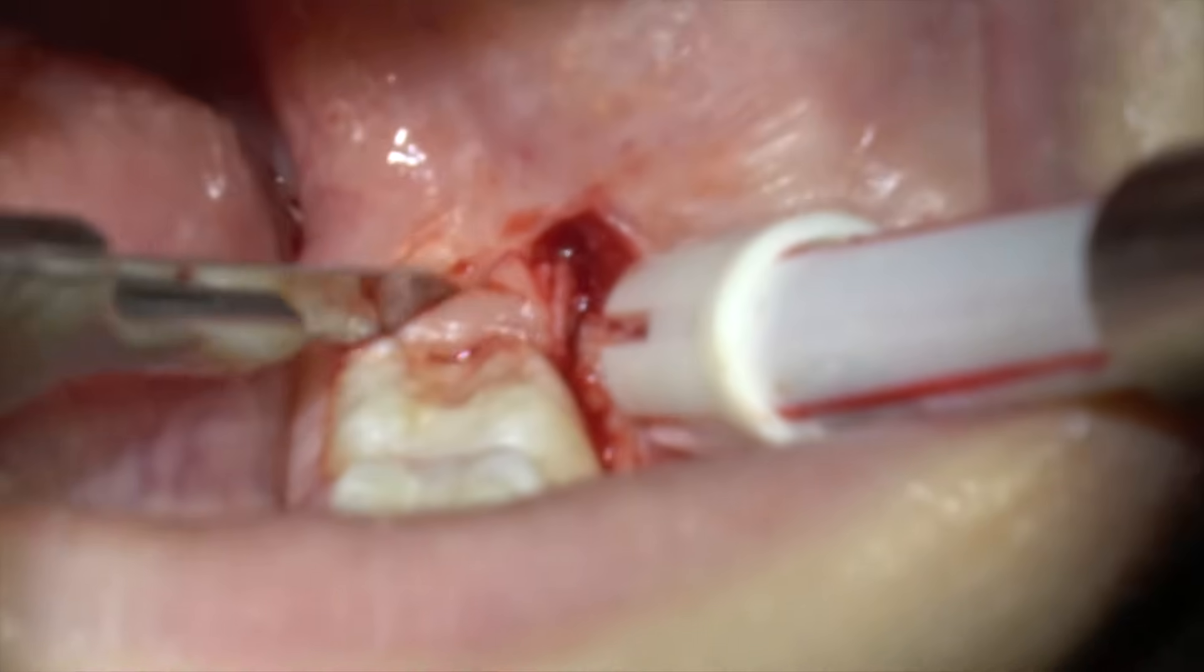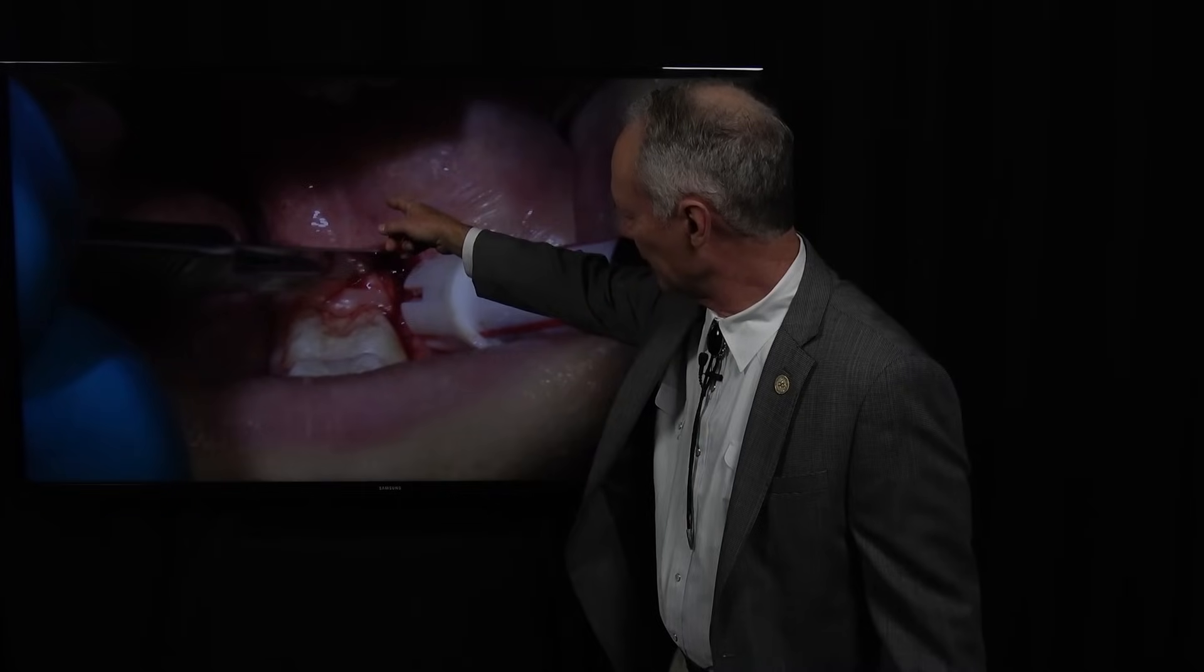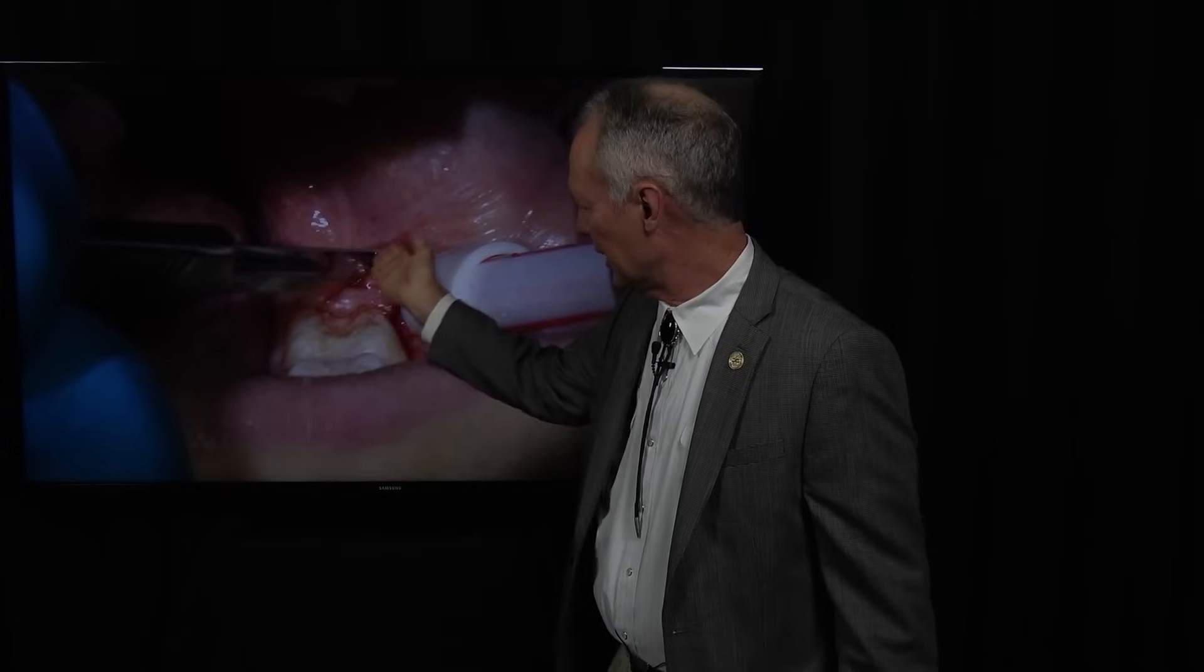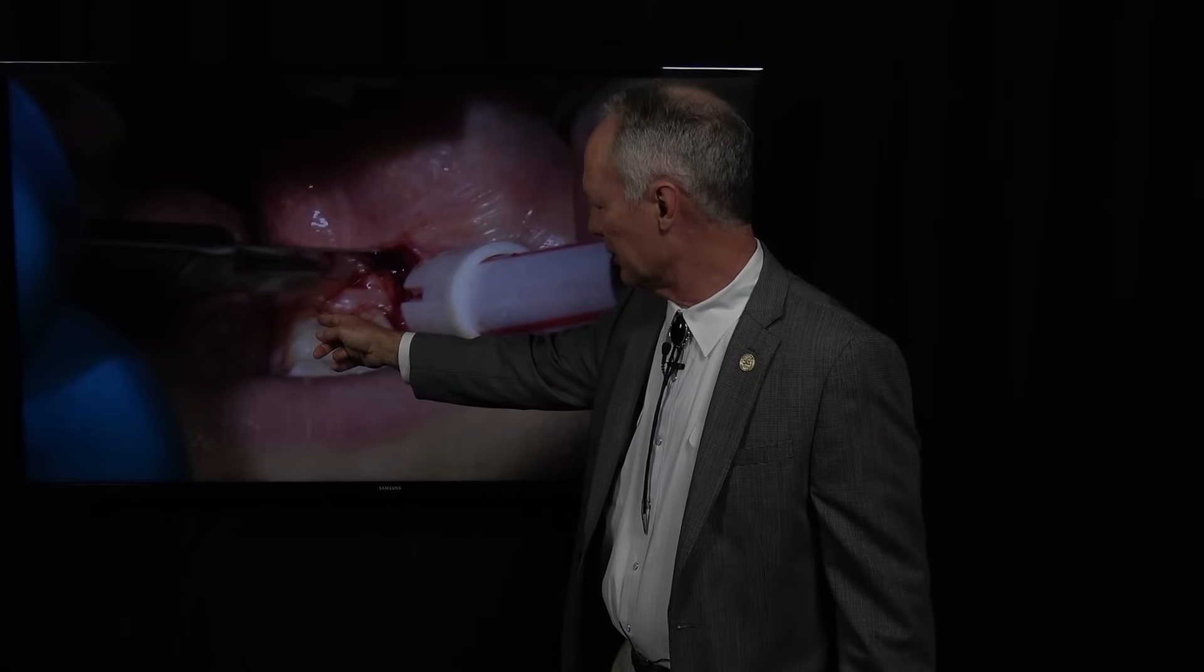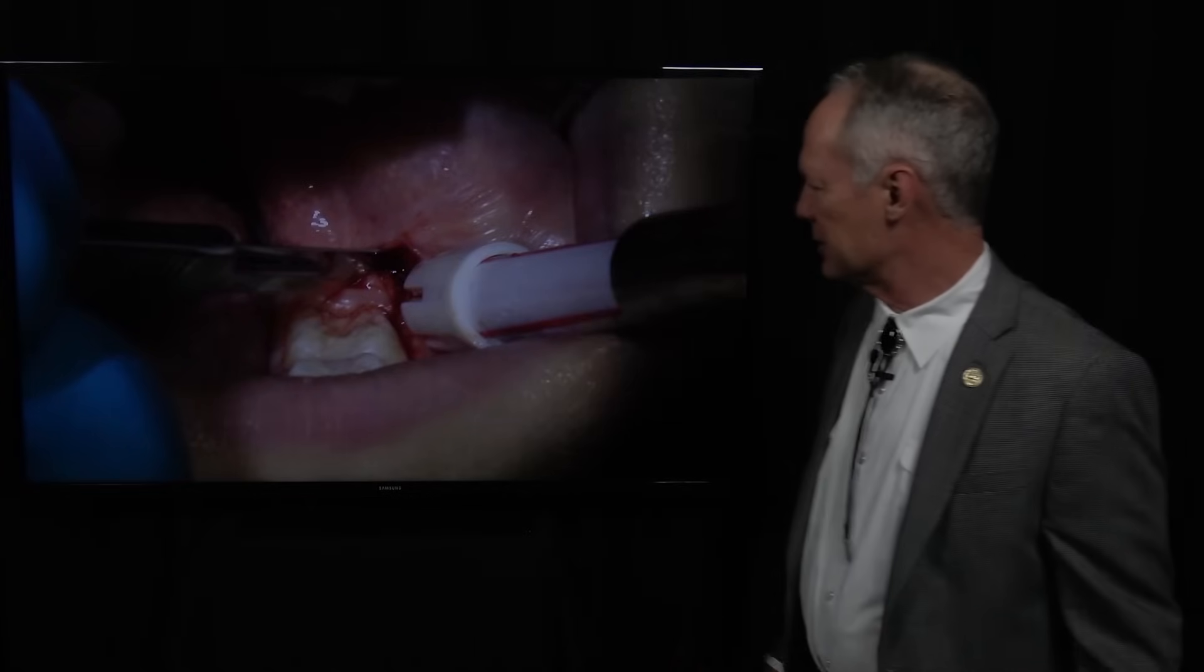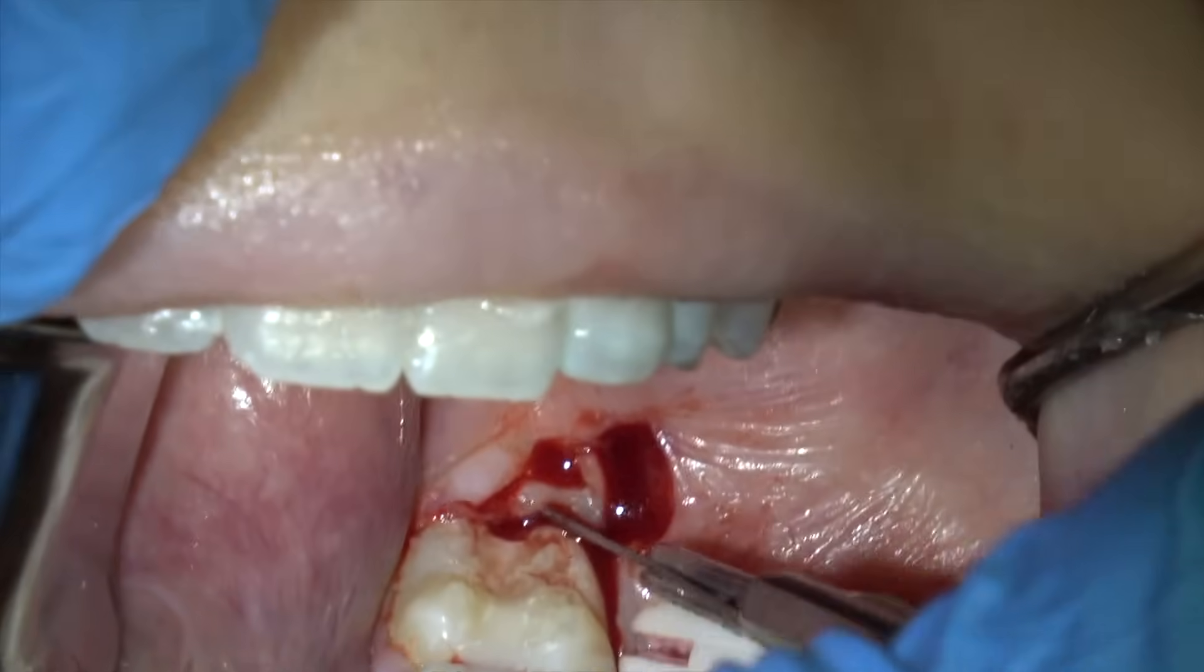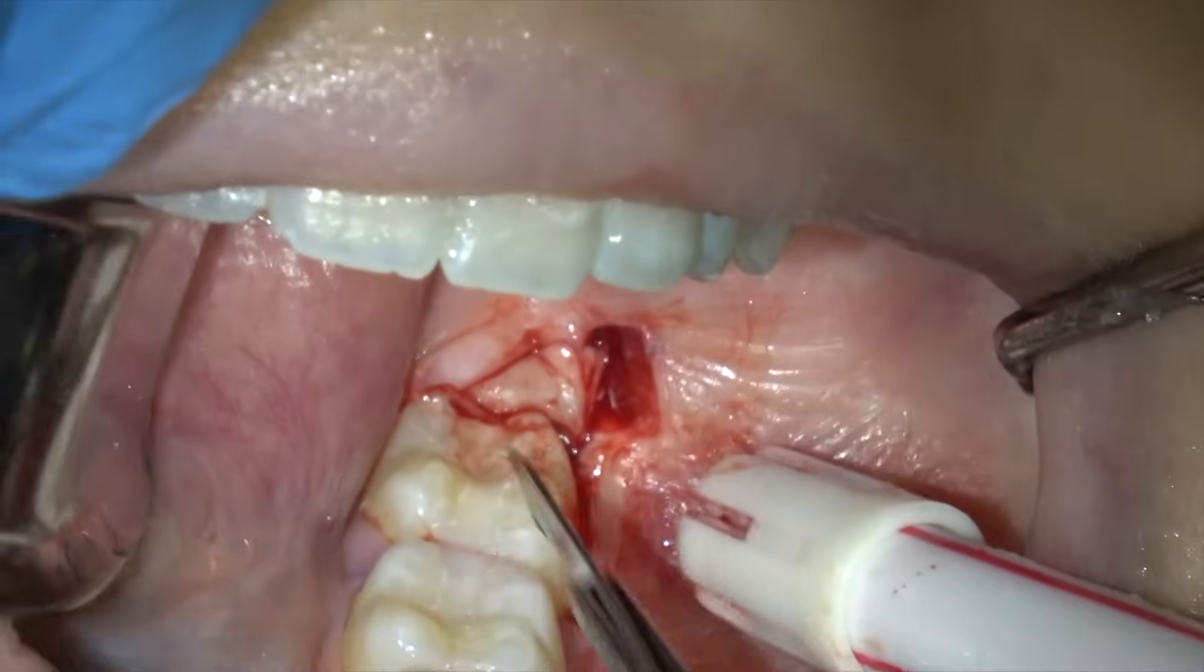So here's the incision. You incise back into the retromolar area all the way to bone and then make another cut to the distal lingual of the second molar. Cut all the way to bone and then you're going to cut just distal to the second molar, creating a wedge and you'll remove that piece with your rongeurs.